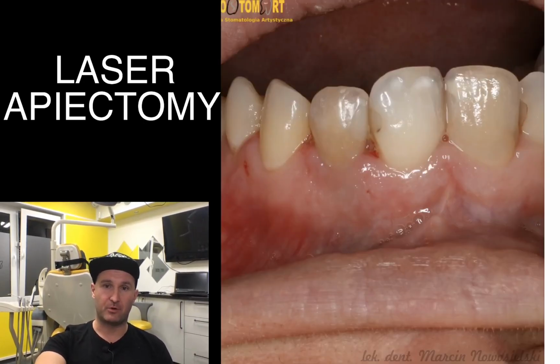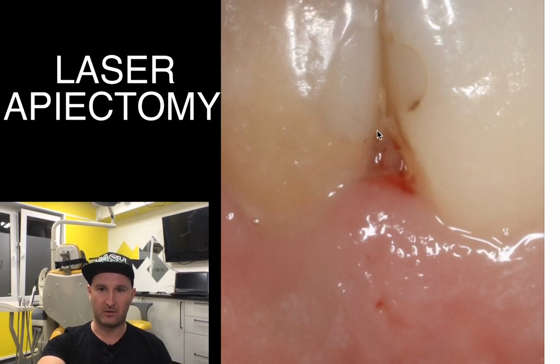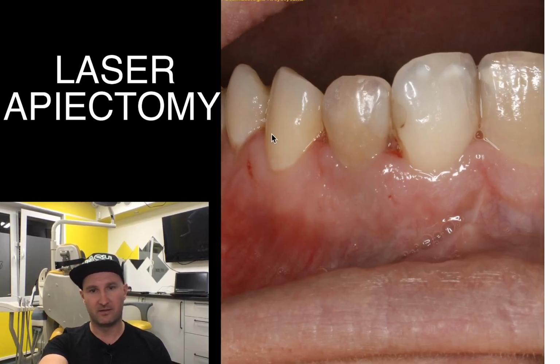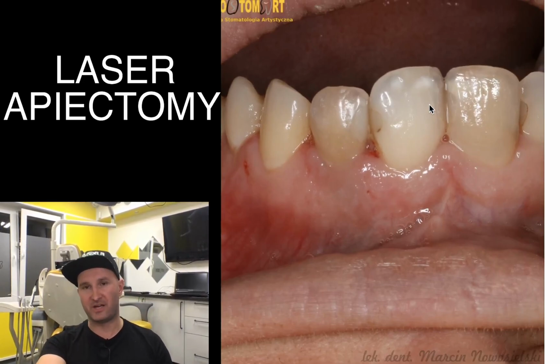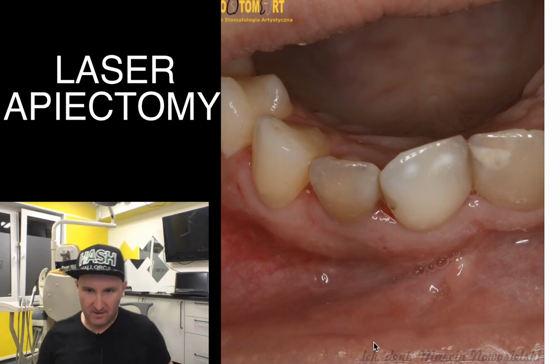Okay, patient reported to us after 7 days after the surgery, after entire treatment, and then we removed the sutures. As you can see here, the papillas here are delicate inflamed. We can see nearly delicate sign of vertical incision. This blood is after the removing of sutures. Patient did not complain to anything. This is the other angle.